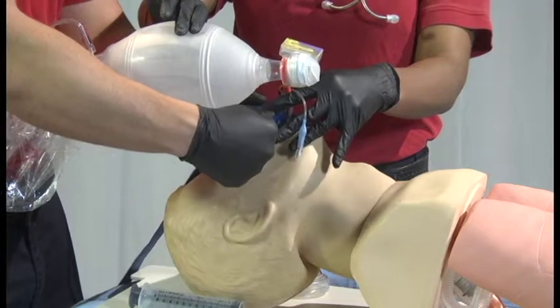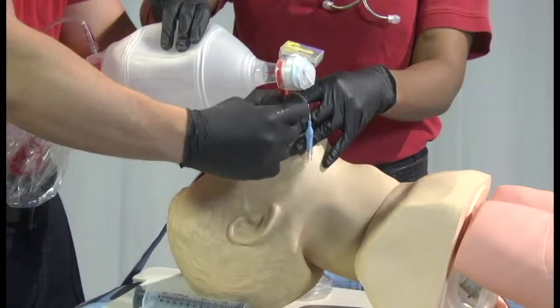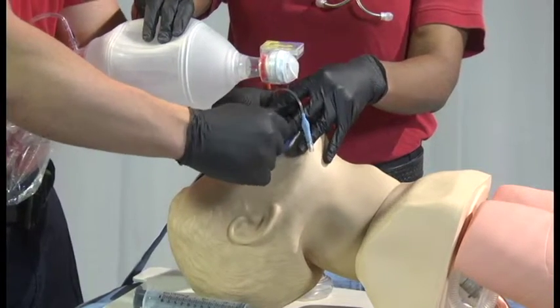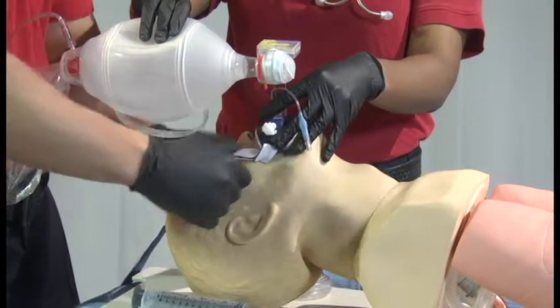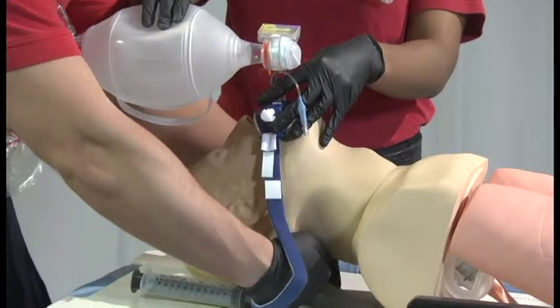Special note: if using a King LTS-D, the posterior opening allows for gastric access. Gastric tubes up to 18 FR may be used. Be sure to lubricate prior to insertion.